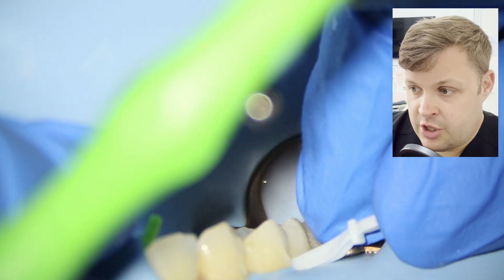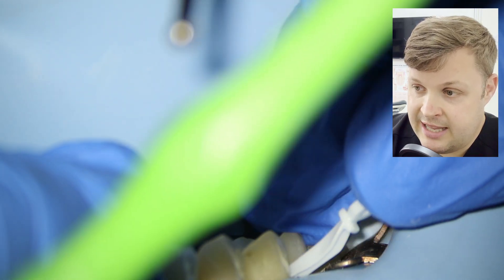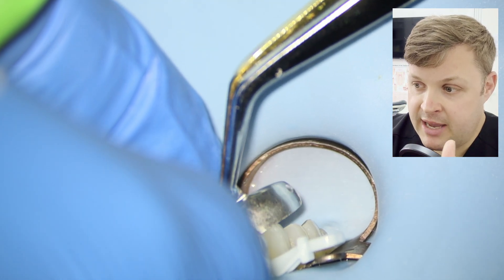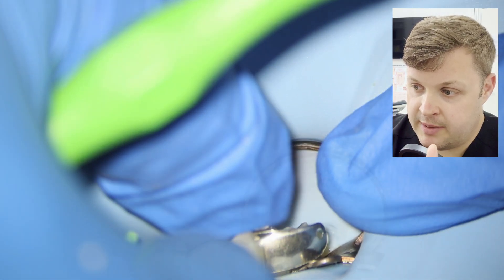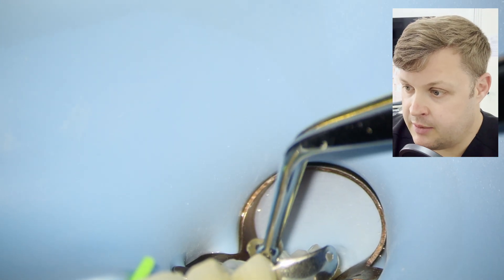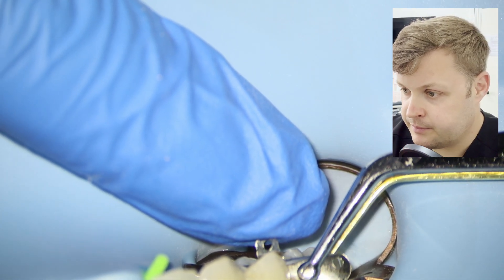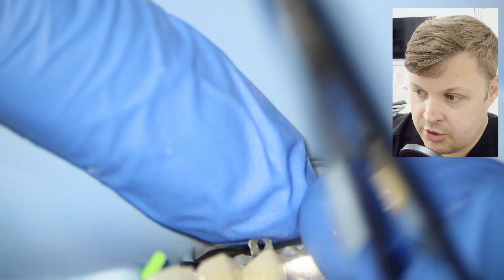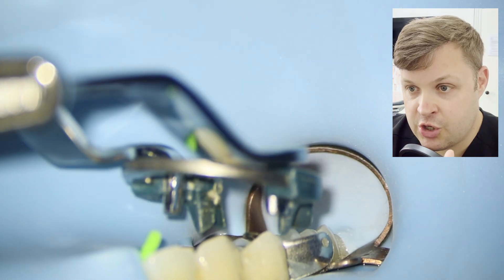What we found is I couldn't physically get the sectional matrix into the gap, so I'm using a wedge to separate the two teeth so the sectional matrix can fit in nicely. Once I move the wedge away I'll push the sectional matrix down and readjust it, as at the moment it isn't perfectly in line. You also don't want to damage the sectional matrix too much as it forms the surface and curvature of the filling.